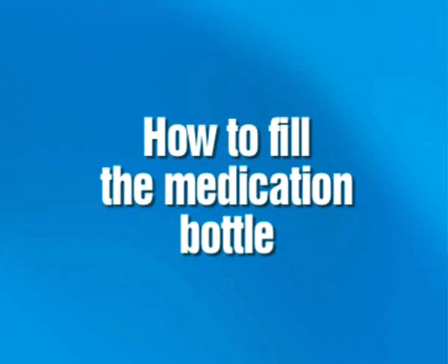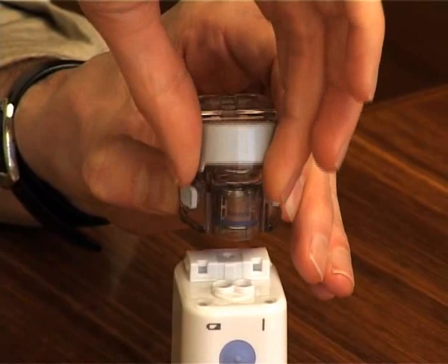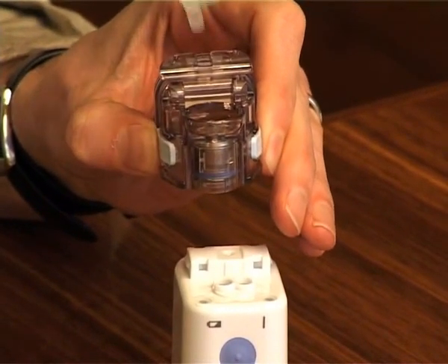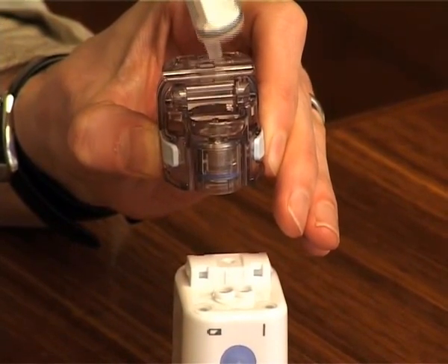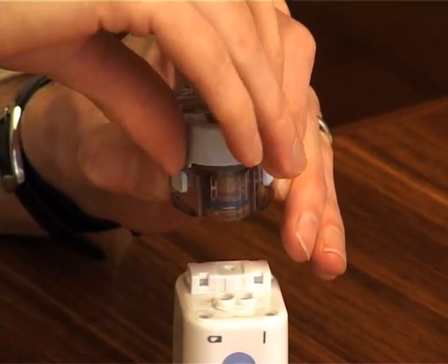How to fill the medication bottle. First, remove the medication bottle from the main unit, then remove the mesh cap. Fill the medication bottle up to 7ml and install the mesh cap. Connect the medication bottle to the main unit.